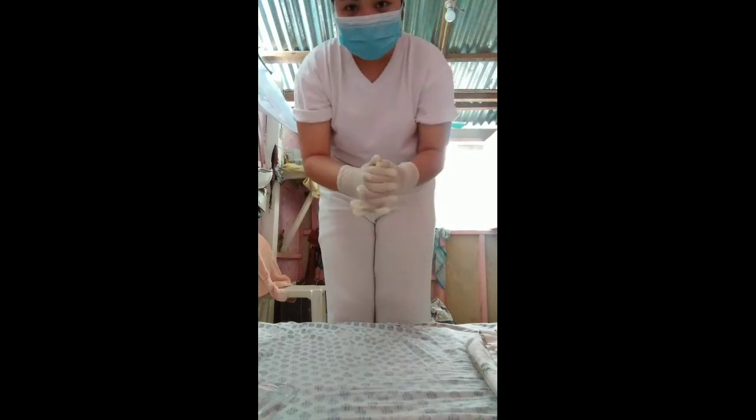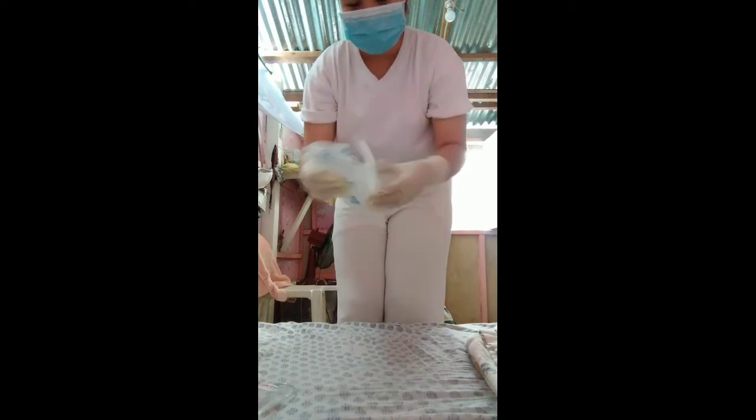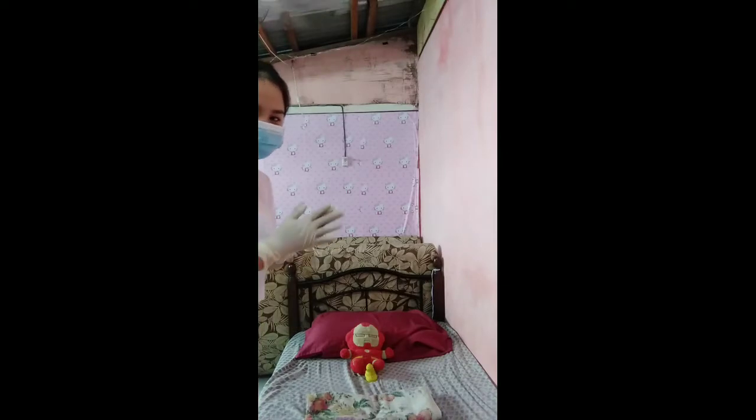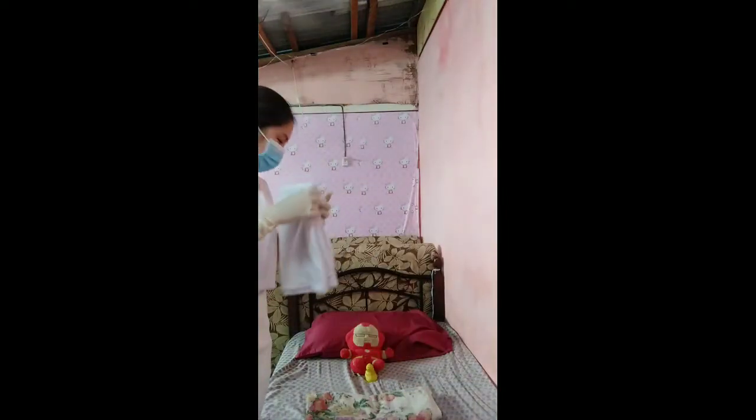So we are done putting on the sterile gloves. The plastic, let's put this away.